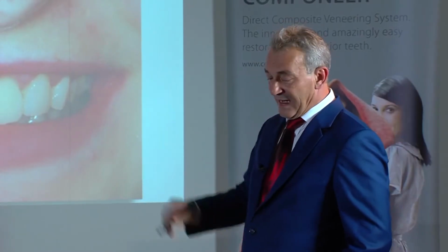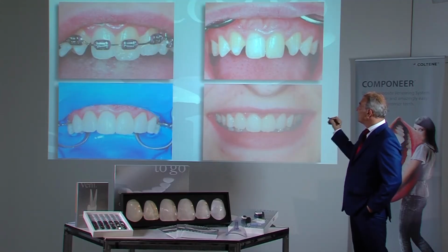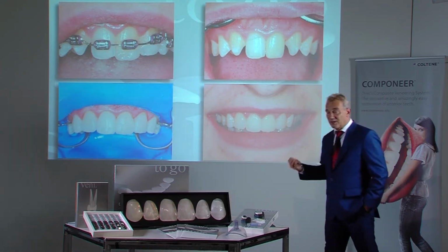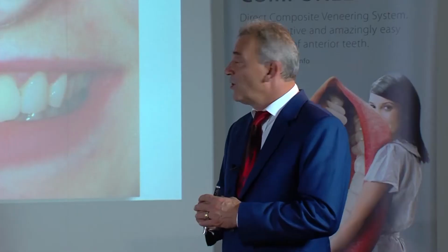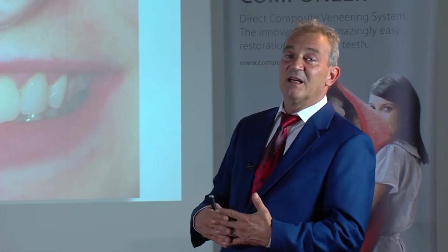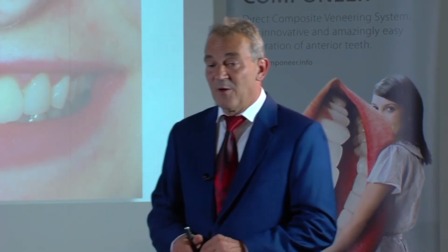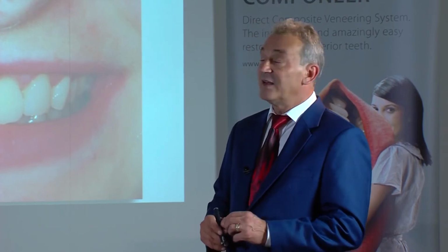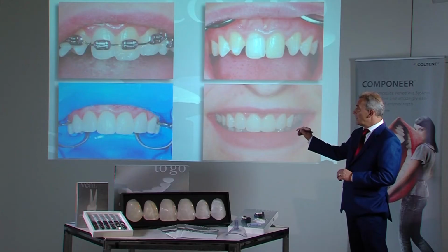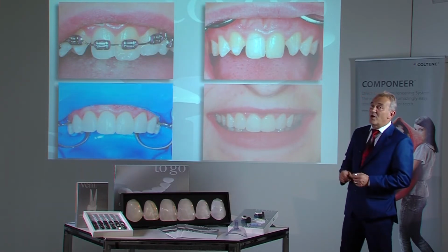In this case, we see an individual group of teeth. These 4 anterior teeth are involved. The 4 anterior teeth need to be restored. For one, the basic tooth shape of the central incisors is not correct. And secondly, the cuspids have been placed in position by the orthodontist, so that these need to be redesigned as lateral incisors. The group of 4 teeth was reshaped virtually without preparation.